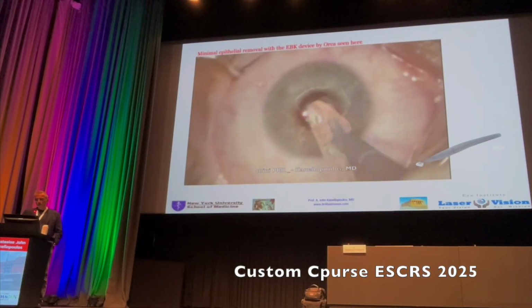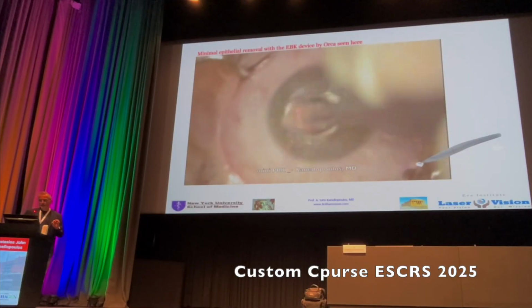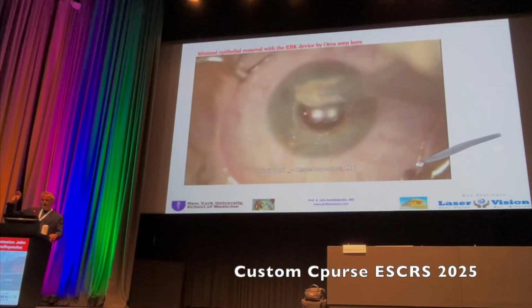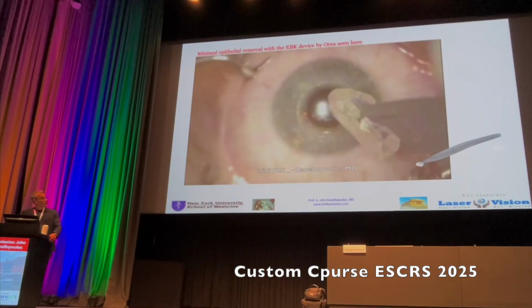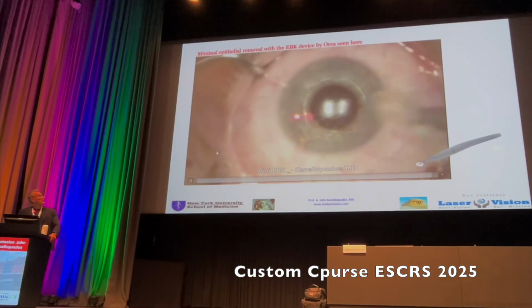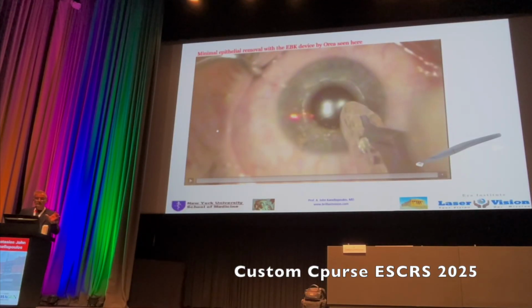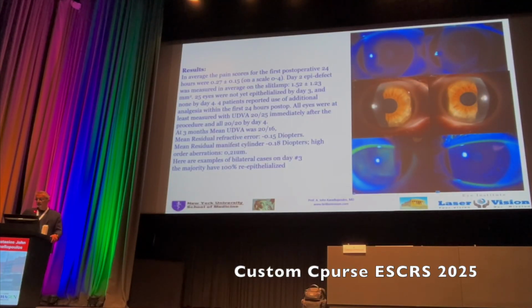That's because I'm going to try and carve out only the epithelial surface that fits my laser ablation profile. So I'm going to make an effort and only remove the amount of epithelium that's needed to fit my treatment. Of course, this takes a little bit of experience to have a clinical judgment of how wide you should go. And the reason for this is that this is 2 days after procedure, and all these eyes have re-epithelialized. We have an e-poster in this meeting as well.